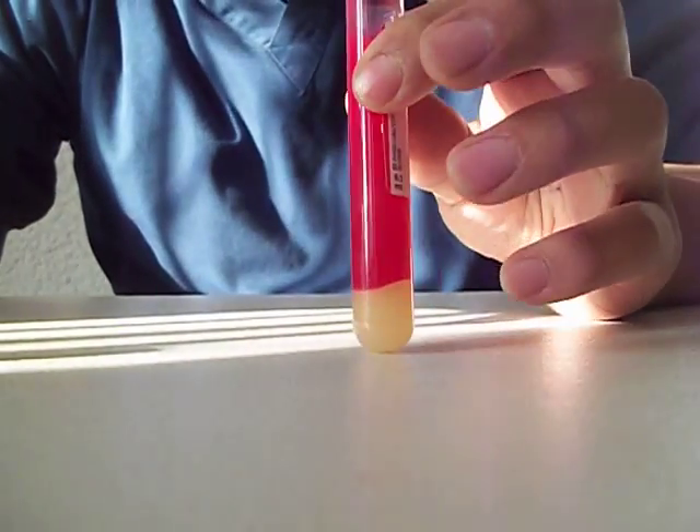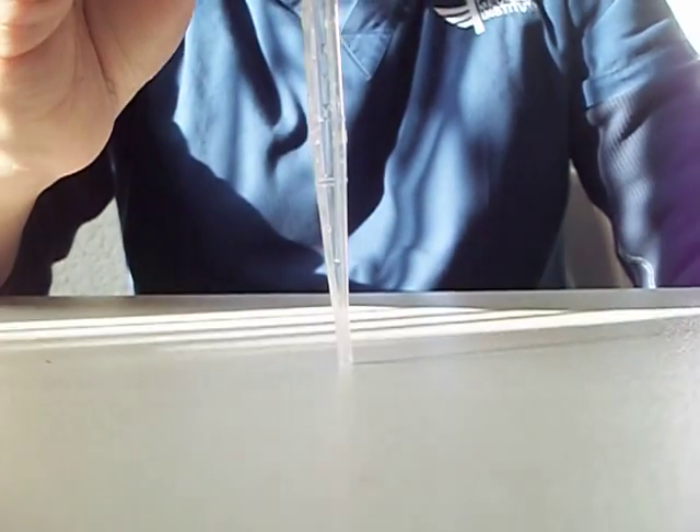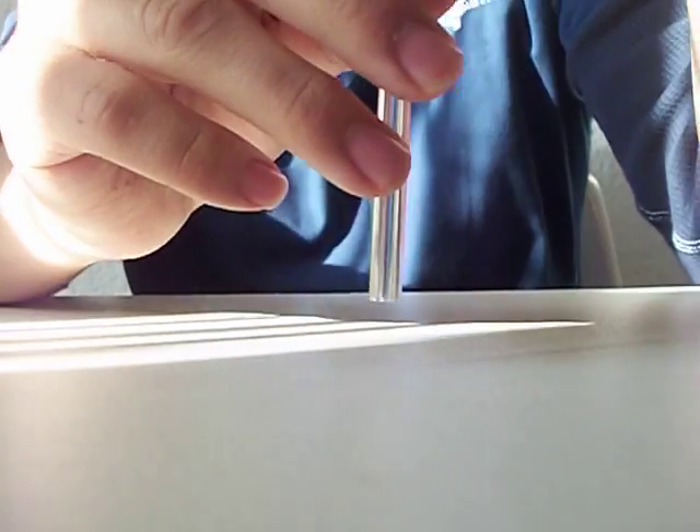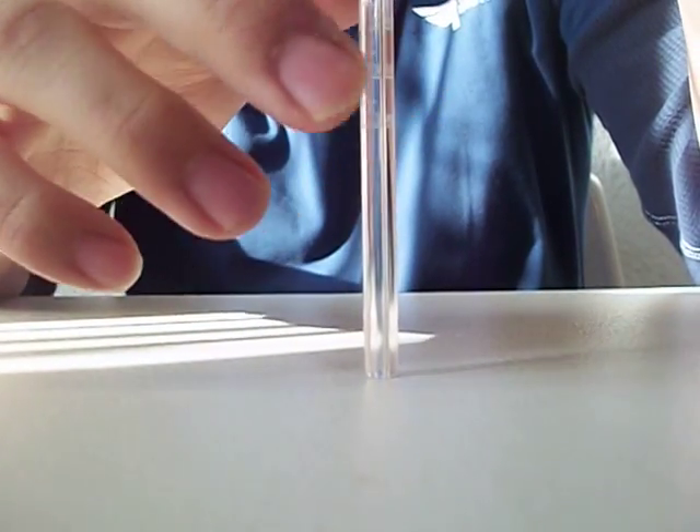Hello you guys, I'm going to be showing you how to perform an ESR test and I'm going to need a few things. First of all I'm going to need the blood sample, then I'm going to need the plastic pipette, then I will need the ESR tube right here, and at last I will need the ESR measuring device.